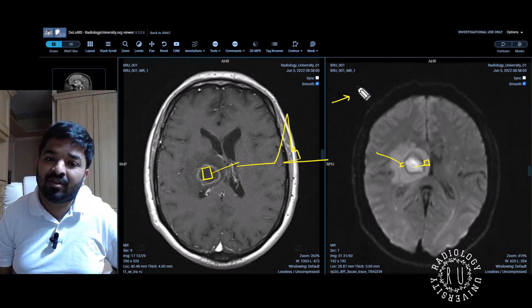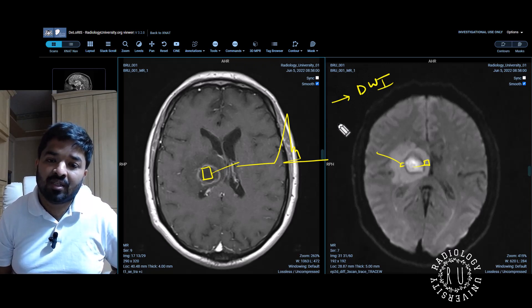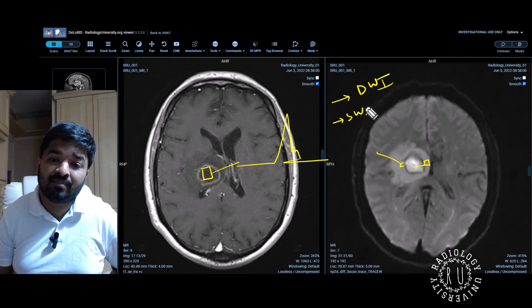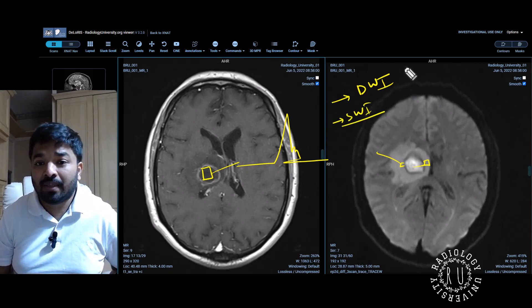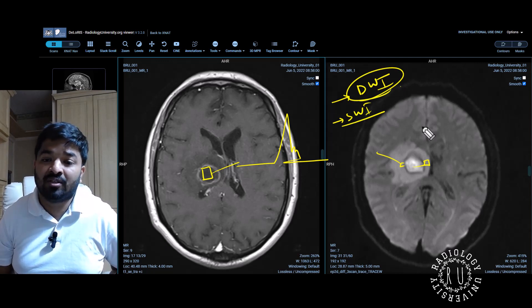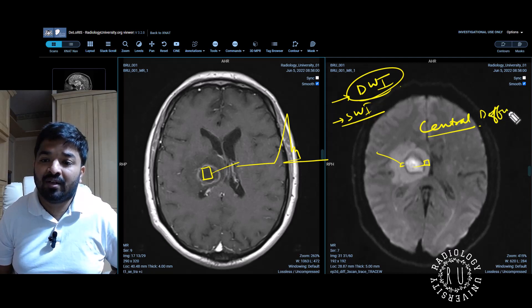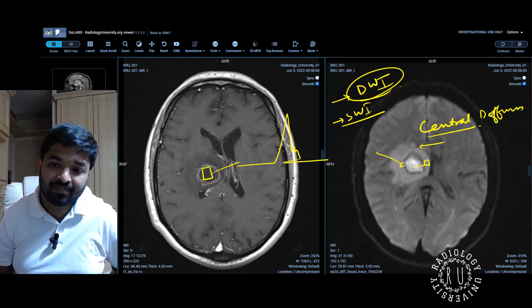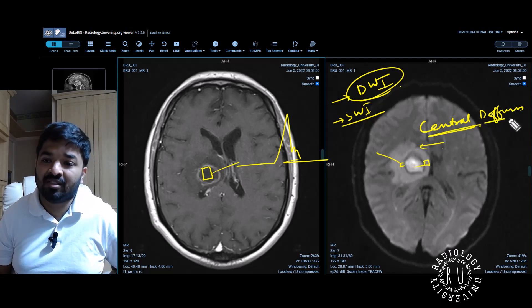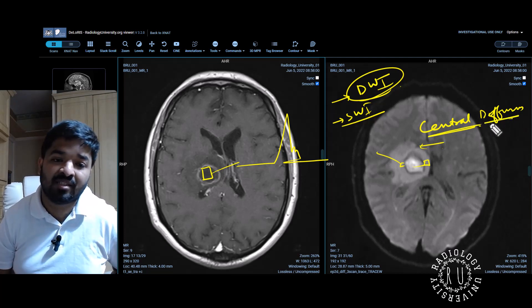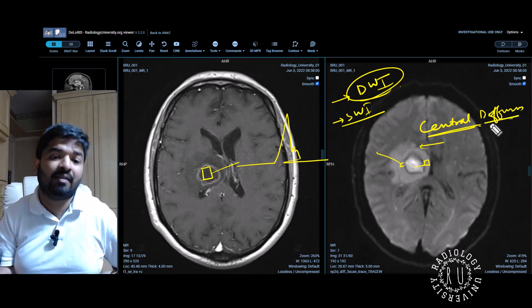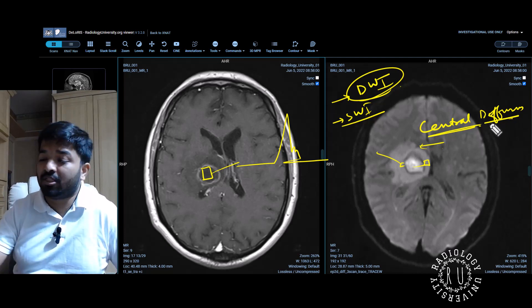In your exam, I would expect you to know diffusion. If you know SWI as well, well and good. But you need to know diffusion, and you need to say there is central diffusion restriction and peripheral edema. Because this is central diffusion restriction, I am considering this as an abscess rather than a tumor. And that's it.